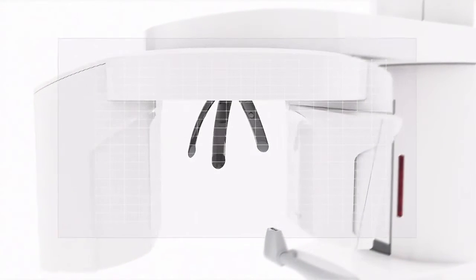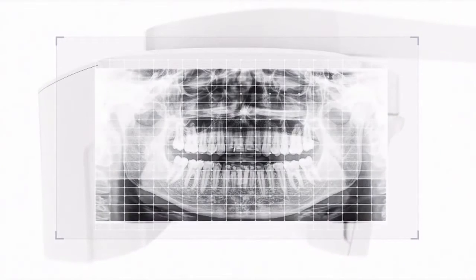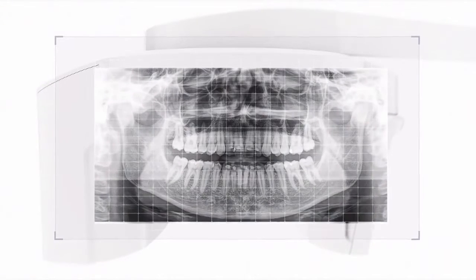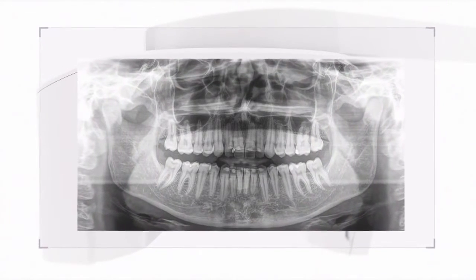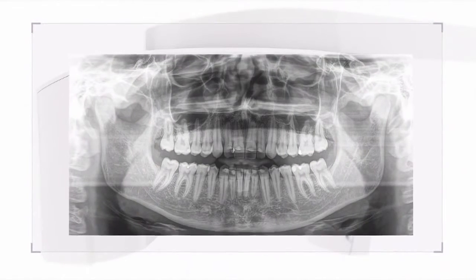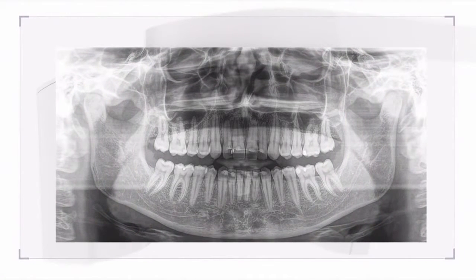The SL technology allows several thousand pictures to be created during one rotation. And of these pictures, the fragments with the best focus are pieced together to give you an incomparably sharp x-ray picture.